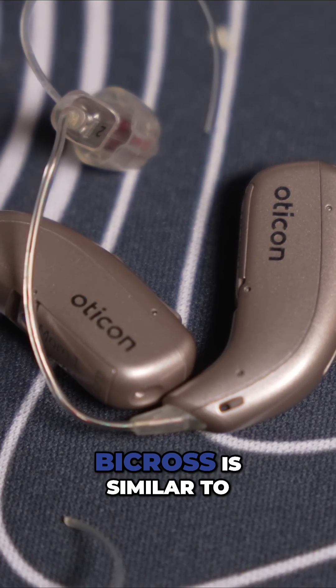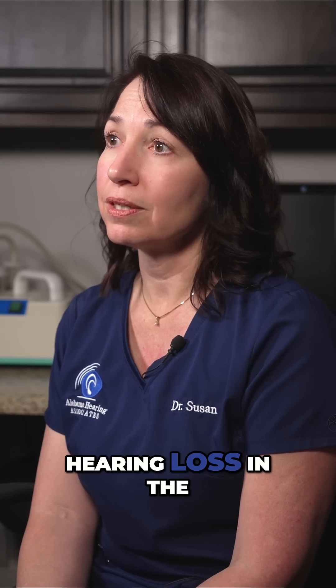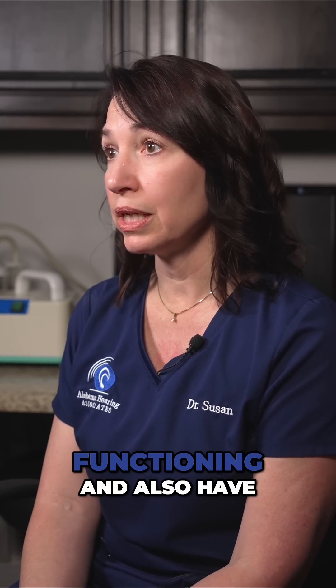BICROSS is similar to the CROSS, but it also addresses hearing loss in the better ear. So you can have one ear that's not functioning and also have a hearing loss in the better ear.